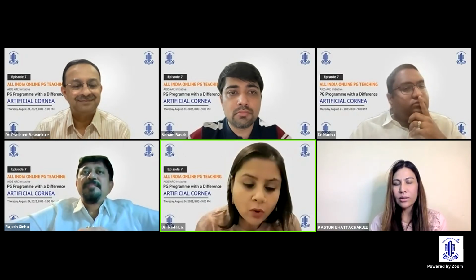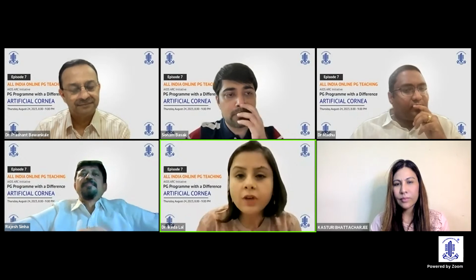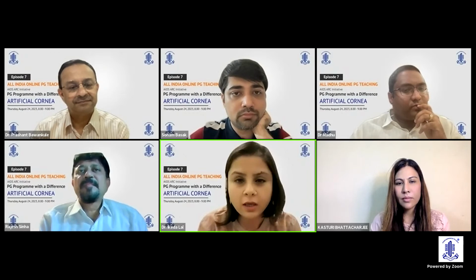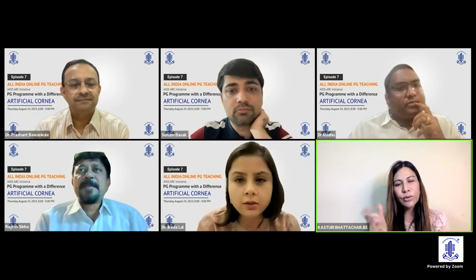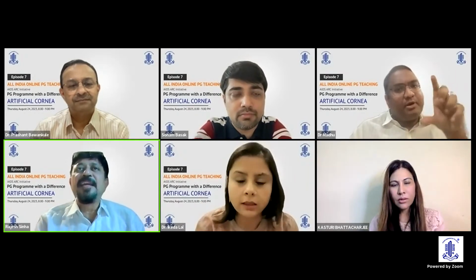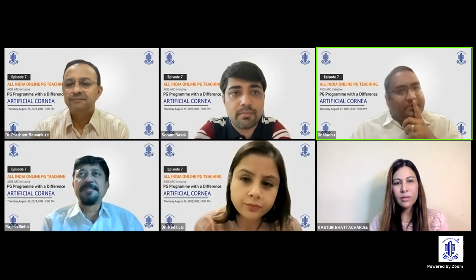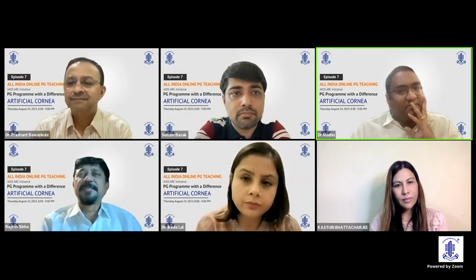Ma'am, it comes in 2 modes. I think the Boston one and the Oro K-Pro come in 2 modes, the pseudophakic and the aphakic one. So the power depends on whether we are planning the patient to be pseudophakic or we are planning to leave the patient aphakic. Most of the times we need to remove the lens, do a thorough vitrectomy, and all of those things. So power would vary according to that criteria. How to calculate the power? Axial length. There is a table. According to the axial length, the optical cylinder power is calculated. Very interesting. They usually take 1 week or 10 days to manufacture it.